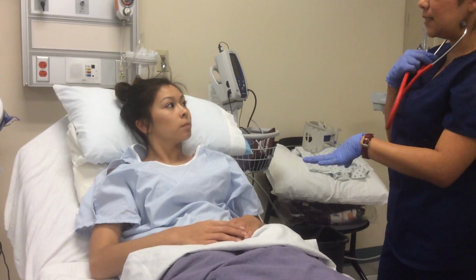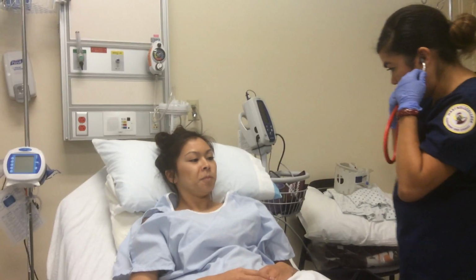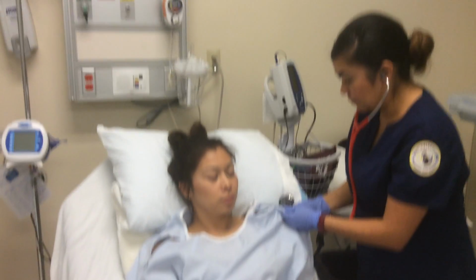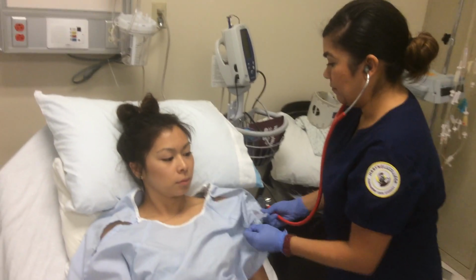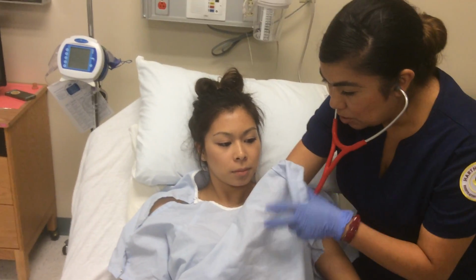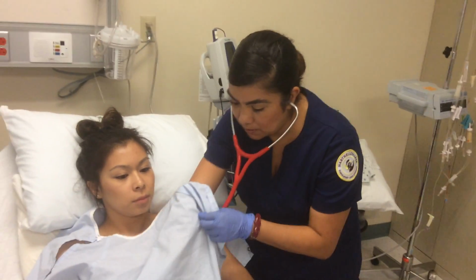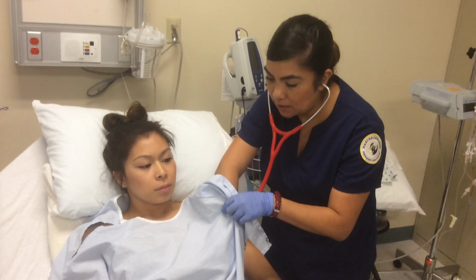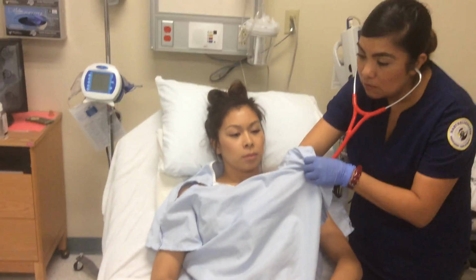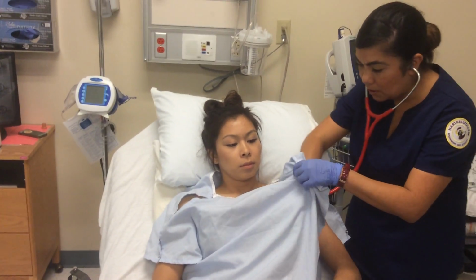Now for this one, since it does consist of me checking the front, is it okay if I snap the gown part a little bit? Okay, thank you. Okay, I'm just going to sneak it in here. Okay, and if you could just go ahead and take a deep breath in. Very good. Go ahead and take a deep breath. Very good. Another one. Okay. Another one. Very good.